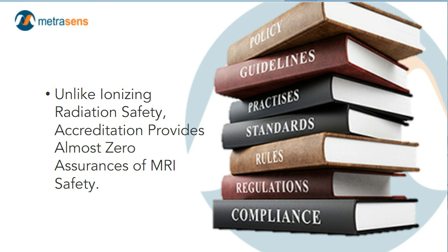MRI is non-ionizing radiation. And so it's almost as if, because the rules for ionizing radiation don't apply to non-ionizing MRI, somebody said, oh, well, in that case, MRI doesn't need any rules.